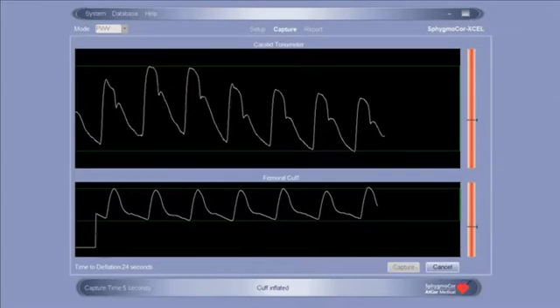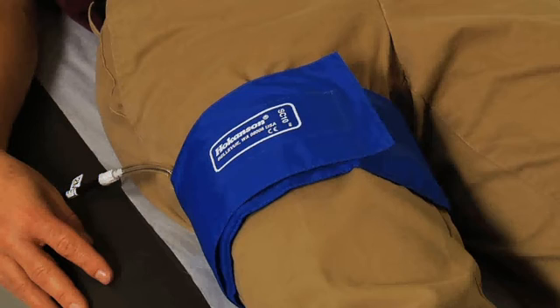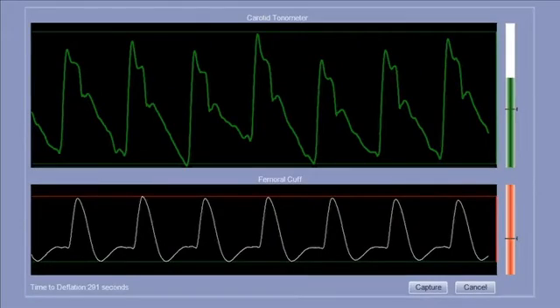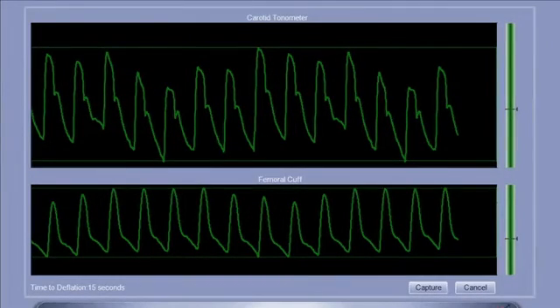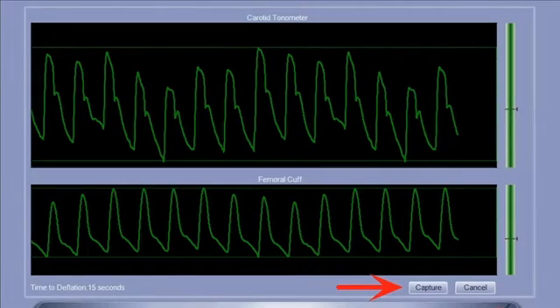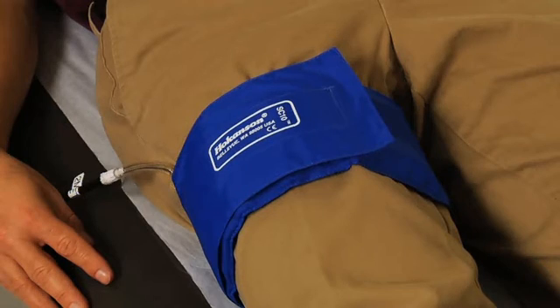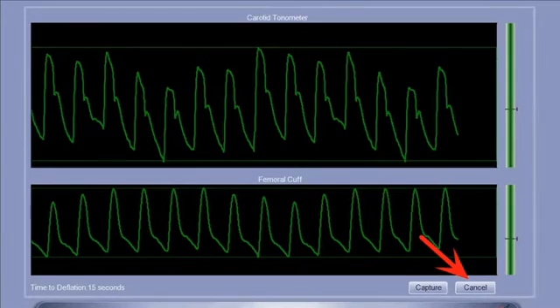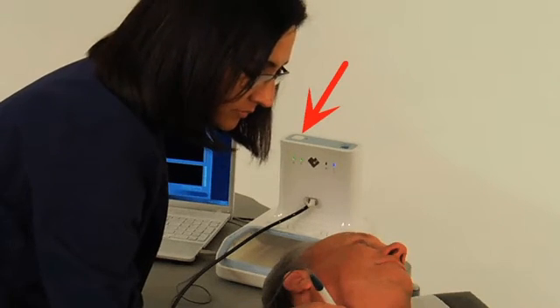Once the tonometer is pressed against the carotid artery, a waveform will appear on the SphygmoCor XL screen. If auto-capture is enabled, the XL system will automatically inflate the femoral cuff and capture both the femoral and carotid waveforms after 10 seconds of quality waveforms have been measured at each site. If auto-capture has not been enabled, press the Capture button at the bottom right of the screen once the carotid and femoral waveforms have both turned green. To deflate the cuff at any time during measurement, click the Cancel button or use the button on the top of the SphygmoCor XL device.